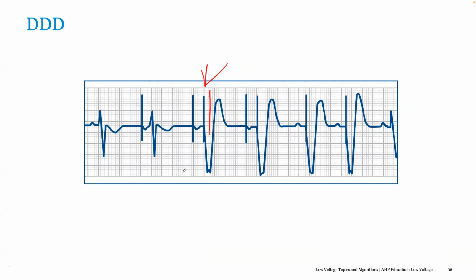Do they have intrinsic conduction? Am I trying to avoid RV pacing? Am I trying to maintain any kind of atrial synchrony? All those things should play a factor.